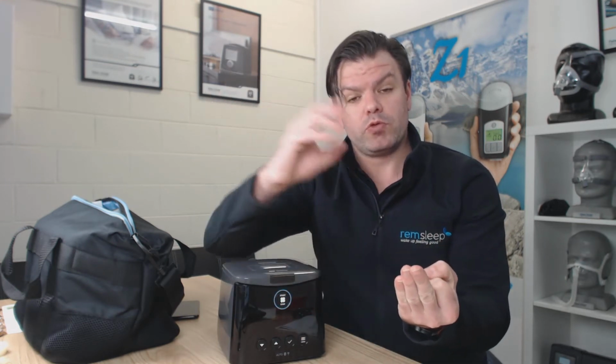As you're exhaling, the machine will drop the pressure to make it easy for you to breathe against that pressure, and it has settings of 0, 1, 2, or 3. So 0 being off, then 1, 2, and 3. The higher you go up in the number, the more the machine will drop the pressure.